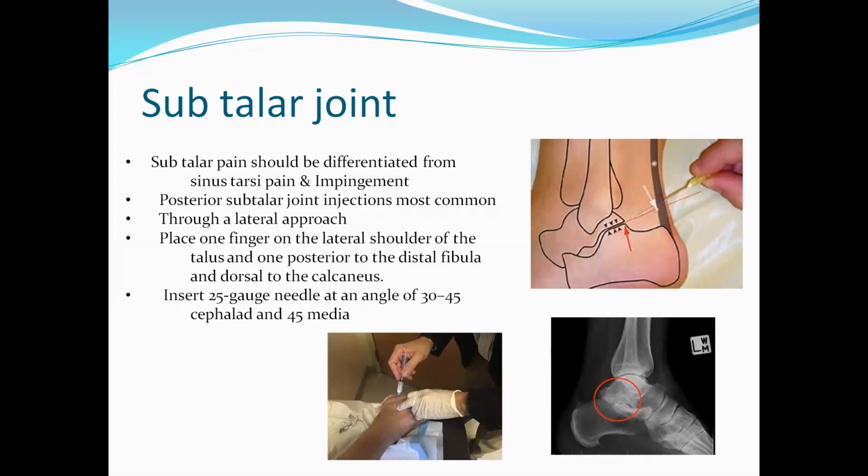Don't worry if you are not confident about the subtalar joint in the posterior facet. Then you can also inject into the subtalar joint through the sinus tarsi with a good volume, which can also spread posteriorly and help to a certain extent in relieving pain of the posterior facet. However, in case of isolated posterior facet arthritis, this procedure is important.